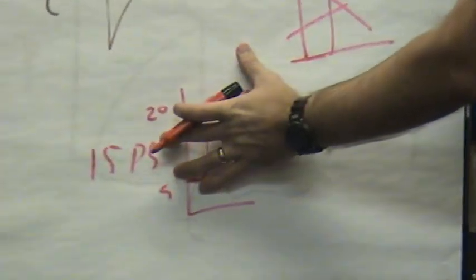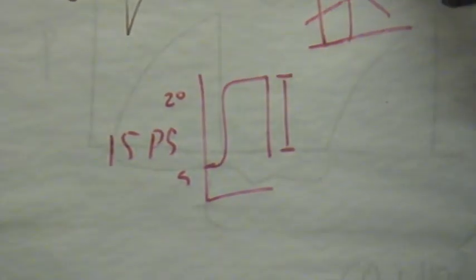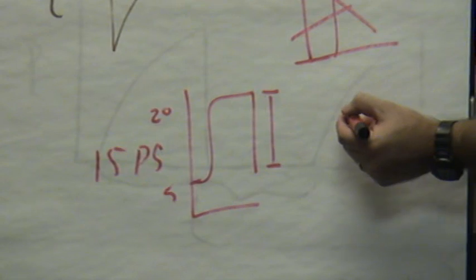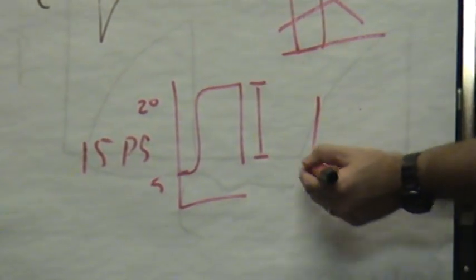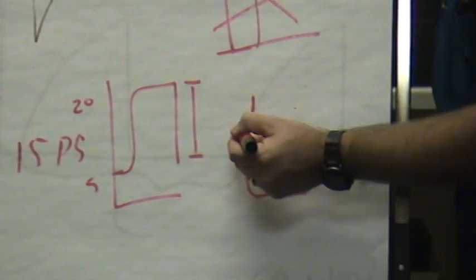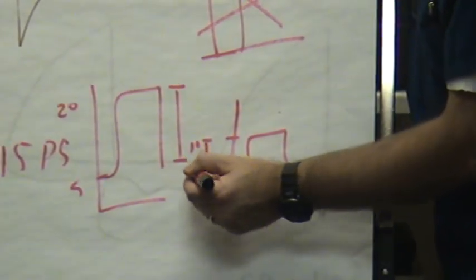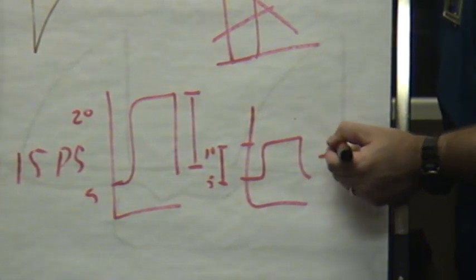By the way, respiratory rate's 18, tidal volume's good, of course, it's set. SAT's good. Blood gases are good. You walk to the next patient's room. Their PEEP's 5. Their peak pressure's 10. So we've got a difference of what? If this is 10 and this is 5, what's my difference there? So they're on 5 of pressure support.